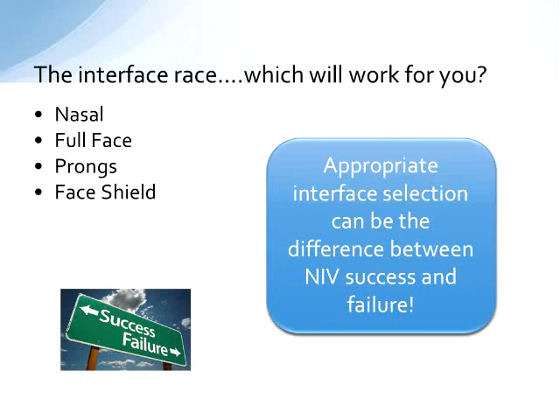So that's the machine. Let's say you've chosen the machine, you're ready to go, and now I think the even harder challenge again is to pick the interface. So which one will work for you? Which one will work for your patient? Which one will work for your patient's family, your nurse, the whole gang? And this is probably the most important decision you can make because choosing the right or wrong interface very often can mean the difference between success and failure in these kids.